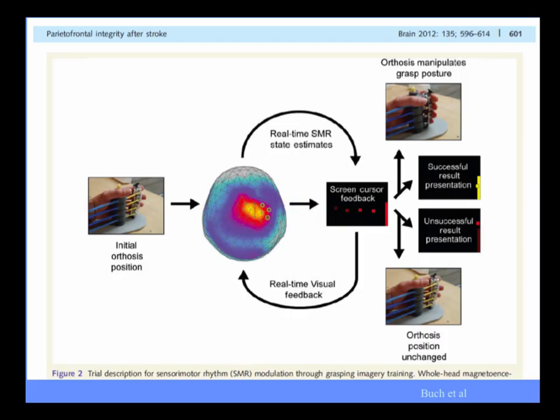The other things that we can do is we can do real-time feedback with MEG, because again, this is an exquisite time signal. We can beamform to a particular spot, pull out a signal. We can do this in real time. It doesn't have to be offline later processing, and we can use that for biofeedback.